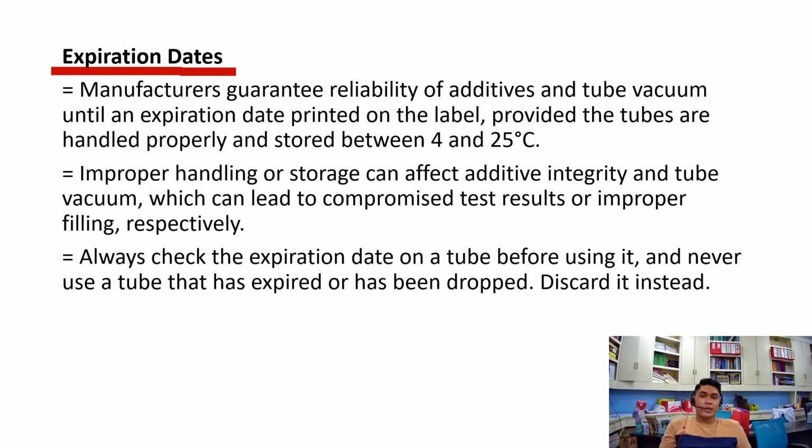Always check the expiration date on a tube before using it, and never use a tube that has expired or has been dropped. Discard it instead.